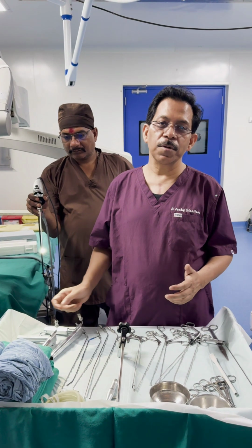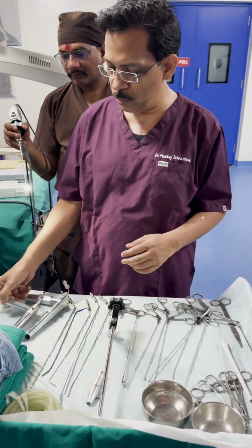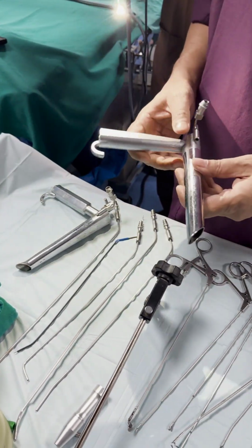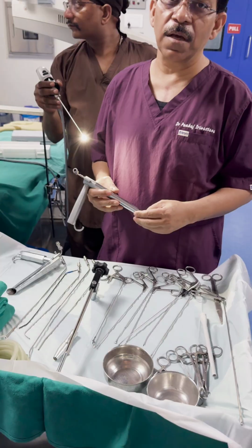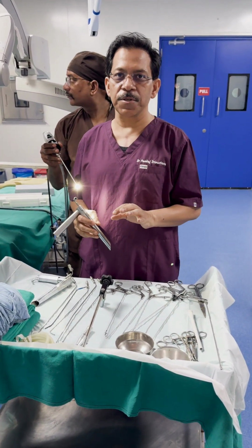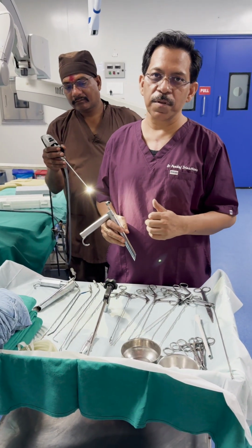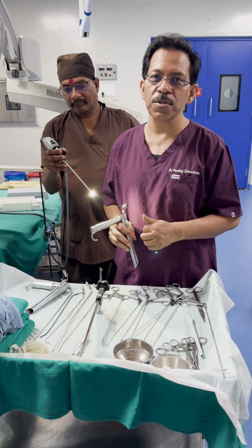There has been a problem in seeing anterior commissure lesions in doing surgery. So what are the options? Definitely they are difficult situation patients, and in OPD we cannot assess that this patient, who may be lean and thin, will not create a problem in seeing the anterior commissure, and sometimes very thick, very heavyweight patients are very easy to reach anterior commissure.